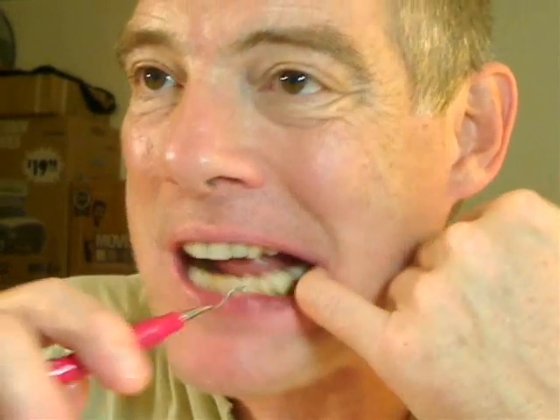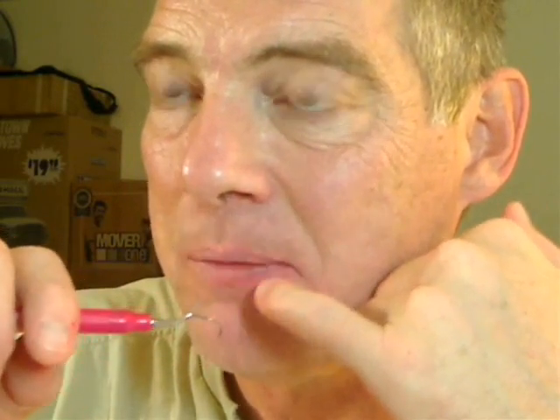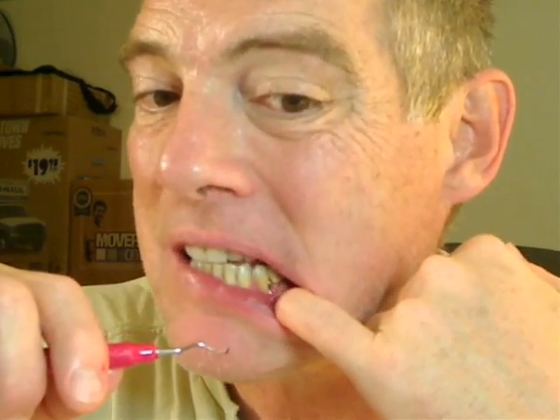I'm working the back of this molar, trying to clear the corner. I have this great opportunity that created itself to get this corner clean, so now is the time to do it — part of girdling the tooth. I also have an abscess in the front, which I may have gotten to partway, but I'm going to do the back corner first, then that corner, and then between the two, this will be a very good operation to help get this tooth back on the path to viability.